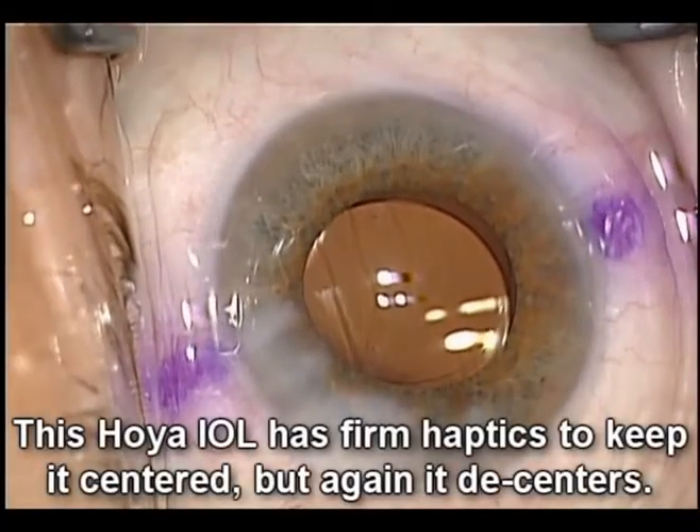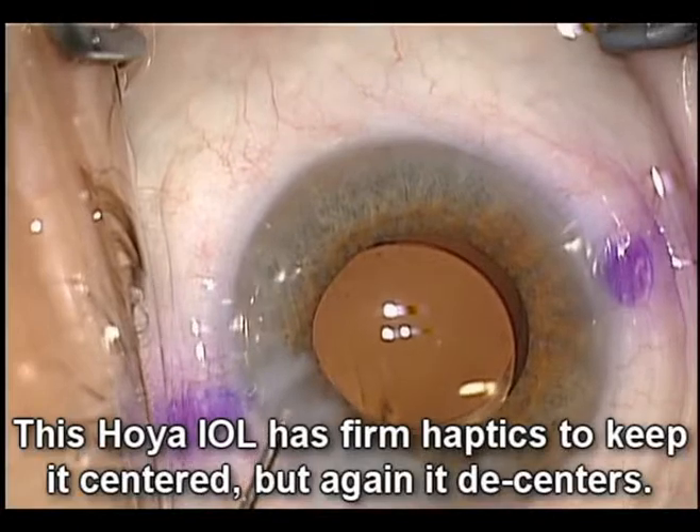With this Hoya lens, the haptics are firm, so you'd expect beautiful centration. So something's not right here.